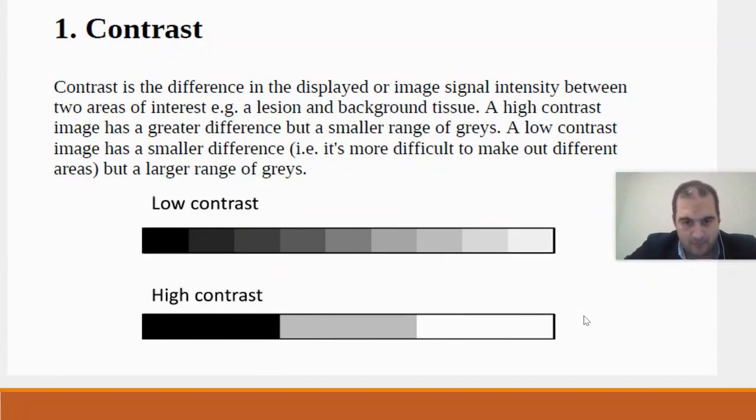As I mentioned, this difference largely depends on the type of object you are imaging, the type of organ, as well as on attenuation, the thickness of the organ or object you are imaging, and also on some acquisition parameters, for instance, how I am using kV, how I am using mA, or how the scan time is set.